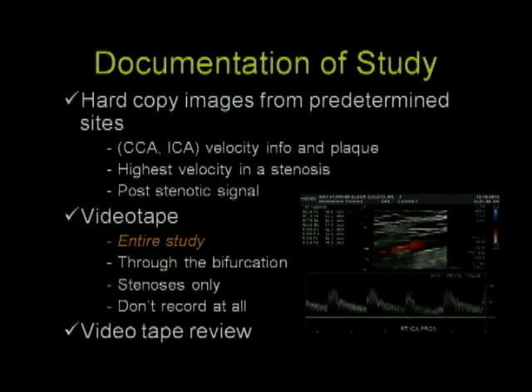Documentation of the study is important, and you should have some mechanism for documenting your studies, and it should be part of your protocol, whether you acquire hard copy thermal paper images or whether you videotape or have a PACS in place. It doesn't matter how you do it, as long as you're doing it the same way every time. At Montefiore, we still videotape our studies, and we videotape the quote entire study. What we do is we acquire representative 10 to 12 second video clips at all of those predetermined sites that I described previously, as well as areas of interest in terms of suspected stenosis or other pathologies.